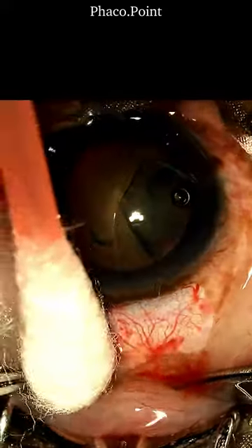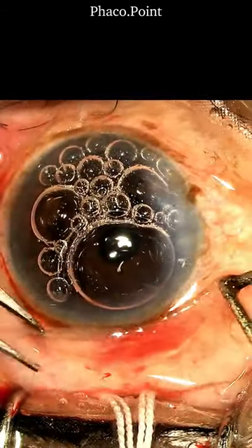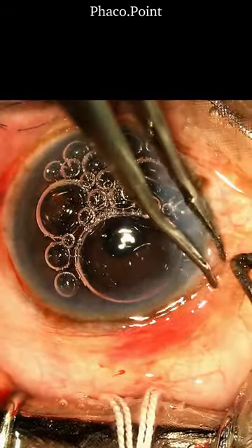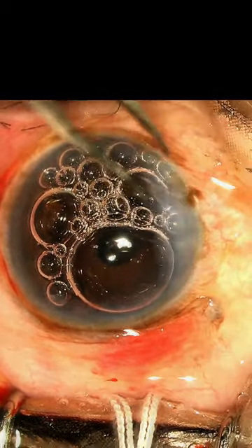Retract the conjunctiva backwards and see if you have created a large enough opening to allow for a comfortable making of your tunnel. A peritomy created like this is very easy to draw back down to the limbus at the end of your surgery and cauterize each end, giving you a perfect end result.